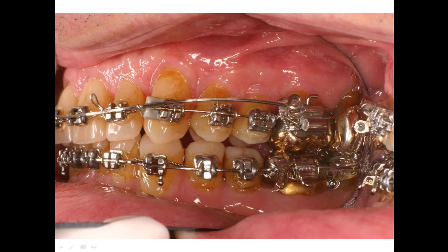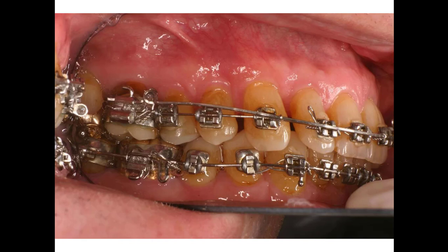If you want to move the roots of the teeth out, you've got to put torque in your arch wire to bring those roots out. Sometimes you won't do that and instead you have the patient wear a lip bumper coming off of this tube in the back to bring it out - we've got illustrations of that in several other videos. Here's the other side - a good view of that auxiliary tube right there. The wire goes in, turns around like that, and then we put it down and hook it over with this arch wire that has the omega on it and is tied back, keeping these teeth from separating.